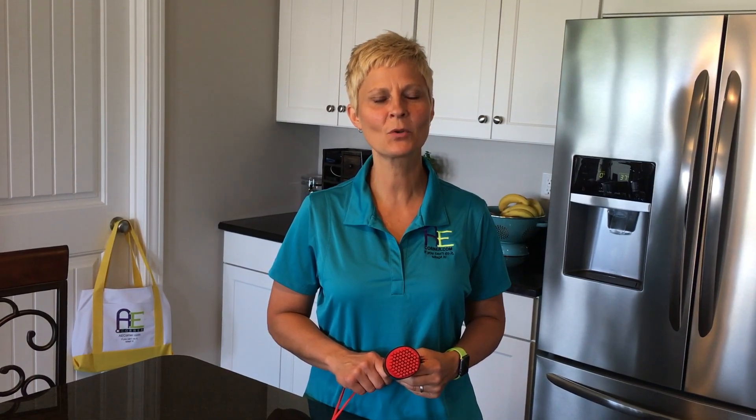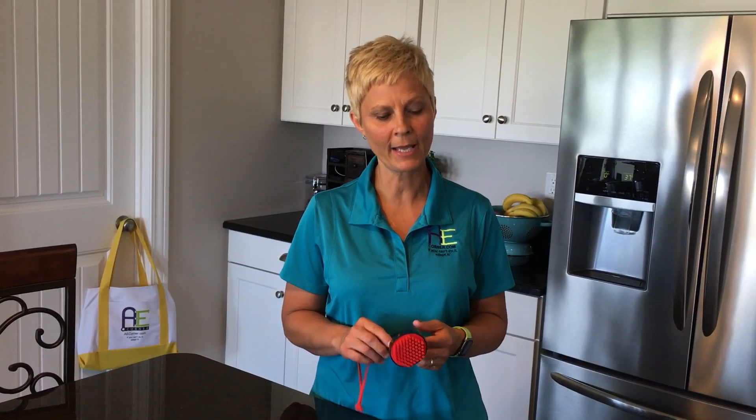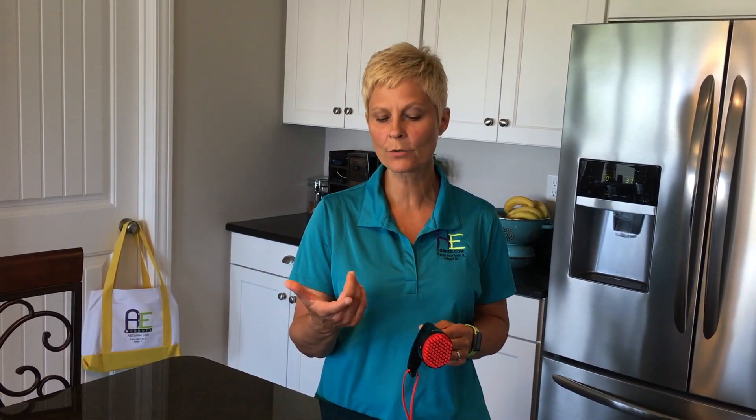Cindy here, Physical Therapist with Adaptive Equipment Corner. Today we're going to be discussing this piece of equipment that I have in my hand. It is called an eTAC Universal Turner, and this can be used if you're having difficulty with grip strength in your index finger and thumb, or if you have difficulty with range of motion.